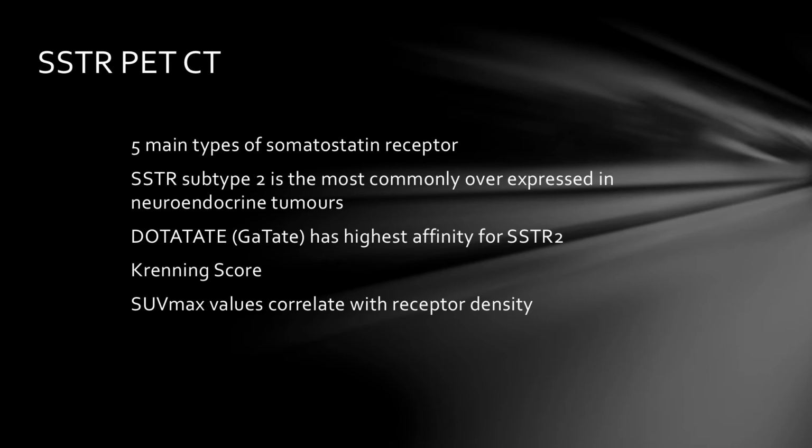The thing about that number is that you can't compare it between different machines. For example, many patients may have had their original scans done at Peter MacCallum Cancer Centre in Melbourne before we got our scanner in Auckland at Mercy. While we can do a subjective comparison between those two, we can't compare those numerical values.